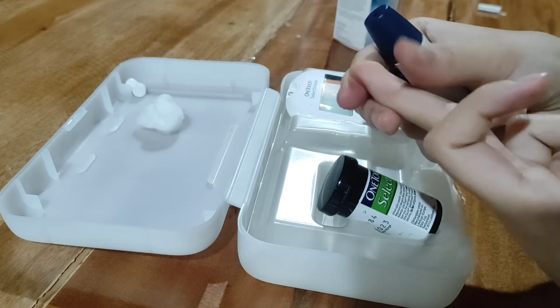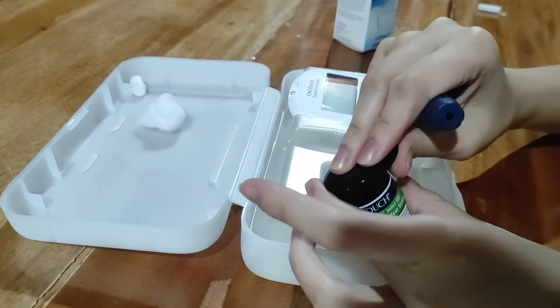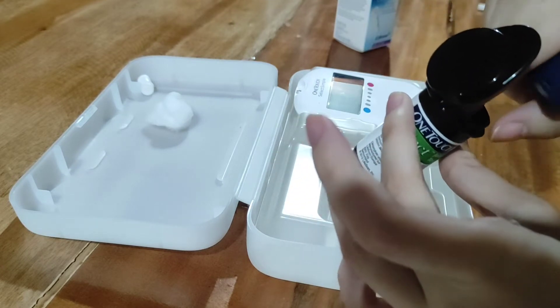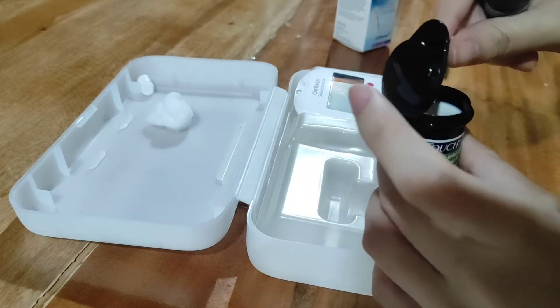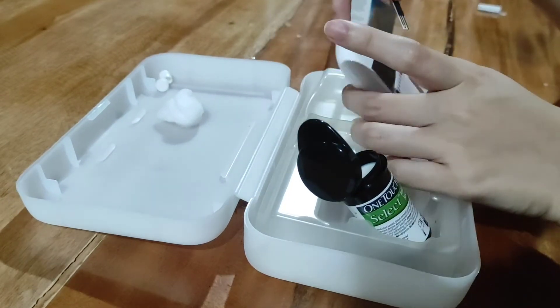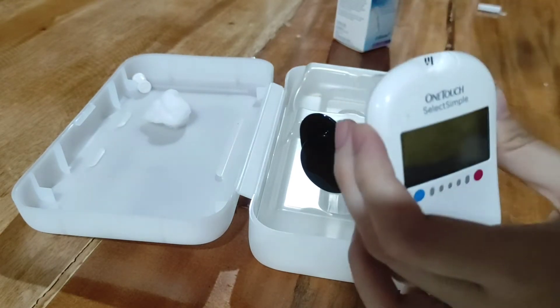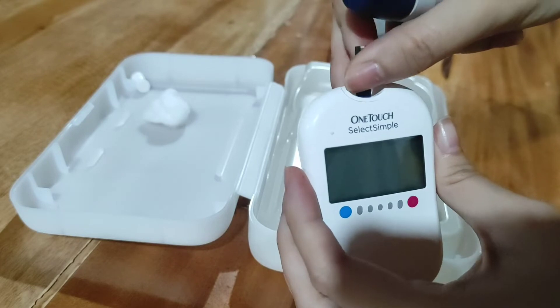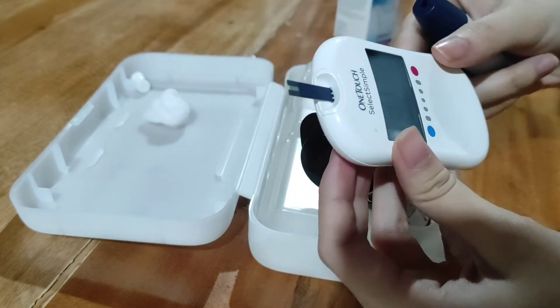After that, kukuha tayo ng strip sa ating glucometer. Lalagay natin sa ating glucometer, and after that lalagay tayo ng dugo.